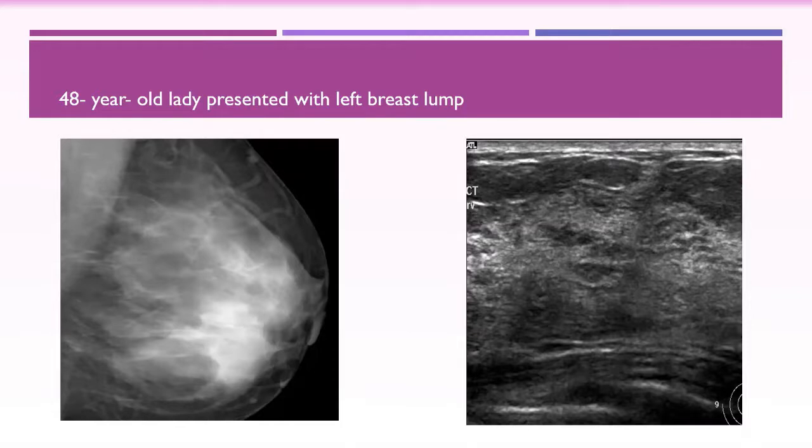You see, during practice, you might be faced with this type, and usually ask the patient to put her finger and put your probe. You will see variable sizes of these palpable fibrous ridges. Most breast ultrasounds are reported as normal findings, and the patient has a palpable abnormality. If retrospectively you come and search, you will find it as a fibrous ridge.